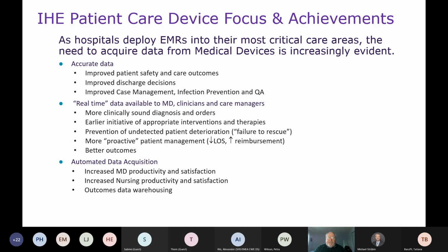So let's move a little bit to the past. It's important to understand what has been achieved so that we can build trust on what will be achieved. The realization in the early 2000s was that hospitals and the way hospitals were managing their devices needed a level of interoperability and integration that was not available, and that was raising a number of issues, even to the point that some hospitals, especially in Europe, were cautious about bringing device data into my medical record.